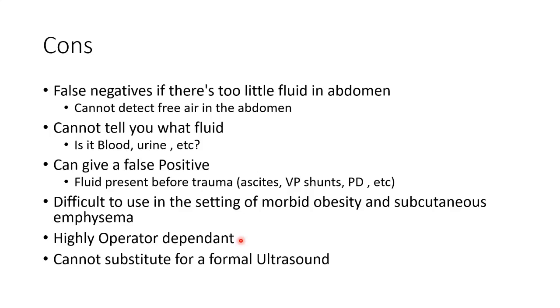This is how many years I've been doing it. This is why I suspect, and I never have a problem. It can never substitute for a formal ultrasound. The reason why I say that is radiologists are trained in ultrasound very differently to how we are. So they will pick up things that we will not pick up.